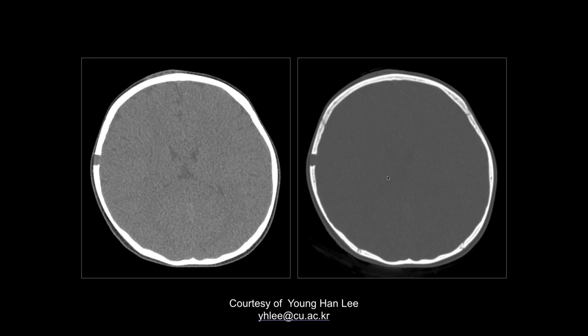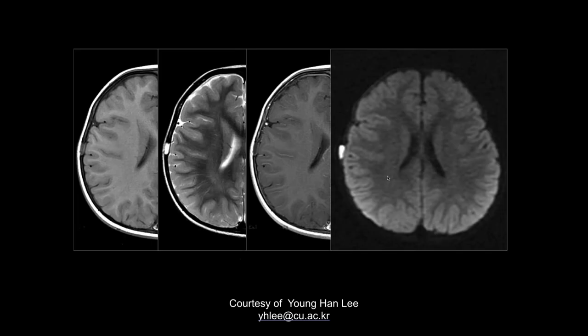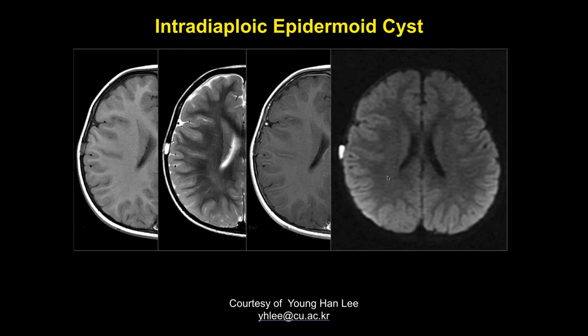And also check to make sure the patient hadn't had any surgery. Yeah, it's so clean that maybe they've had intervention there. This turned out to be an epidermoid.